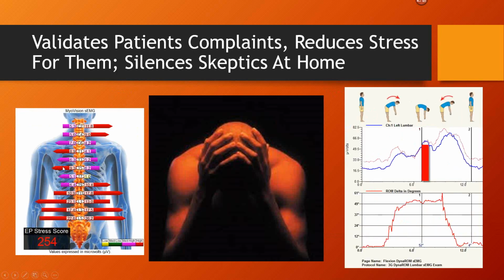Now, one of the coolest things about this, and attorneys have been telling me this more and more lately, there were 9 different machines 10, 12 years ago. There's, I don't know, 1 or 2 left, and that's it. And it's been interesting to see that the machines that are working really well are doing an excellent job. That means that this is getting back to attorneys. They're hearing really good things about the static and the dynamic. But one of the most important things, and everybody forgets this, is that it reduces the stress on patients significantly to actually have something objective to validate their complaints.